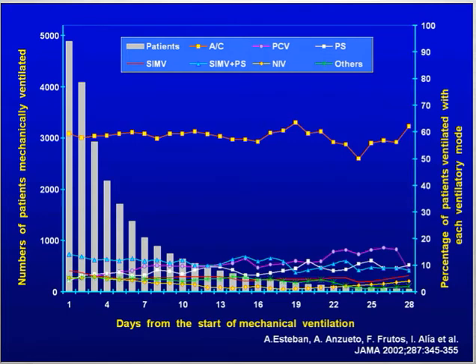The next issue is how often we now use non-invasive ventilation. And we don't have a lot of data. This was an international survey of mechanical ventilation all over the world conducted by Andres Esteban and published in JAMA.